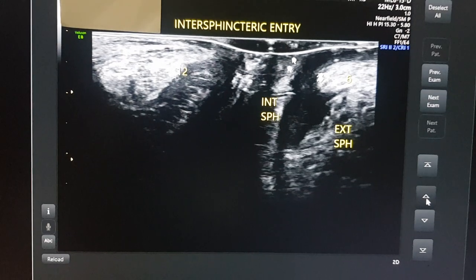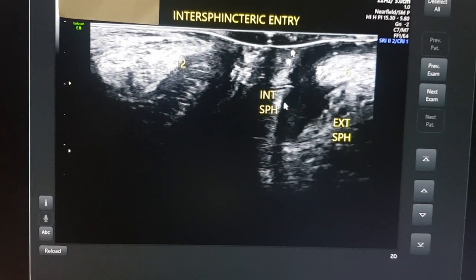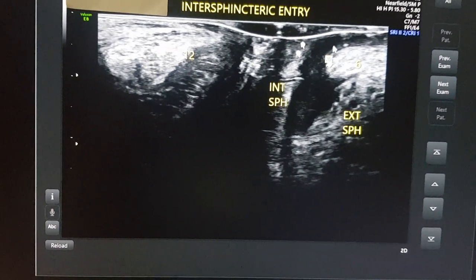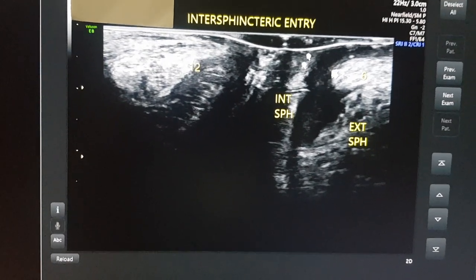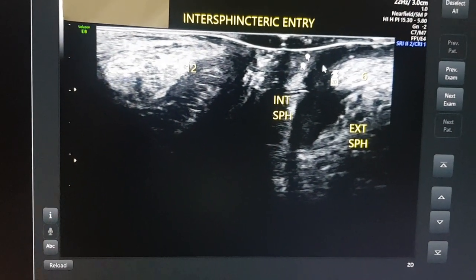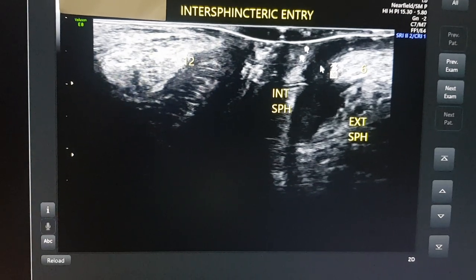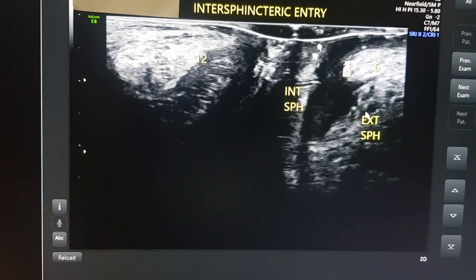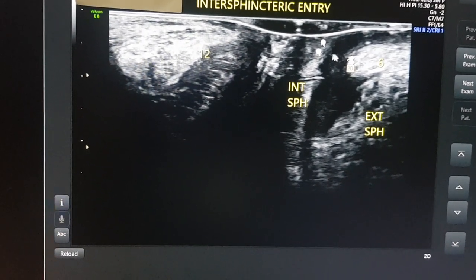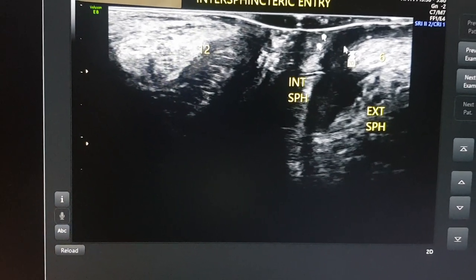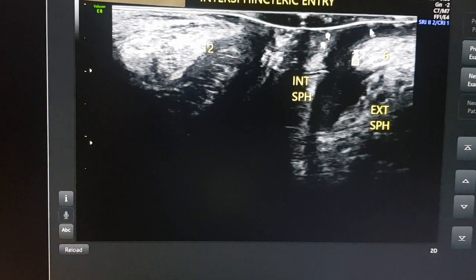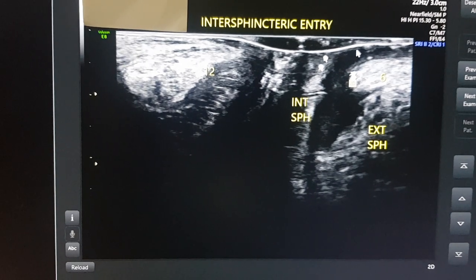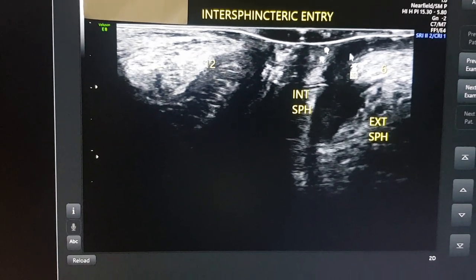Next I move my probe in a sagittal plane cranially. You can see that the entrance of the tract is here. Now I see where the tract enters the anal canal — it enters in the intersphincteric plane. This is the internal sphincter, this is the external sphincter, and I have put arrows here to show the intersphincteric plane. A tract will enter the intersphincteric plane usually close to the anal skin.